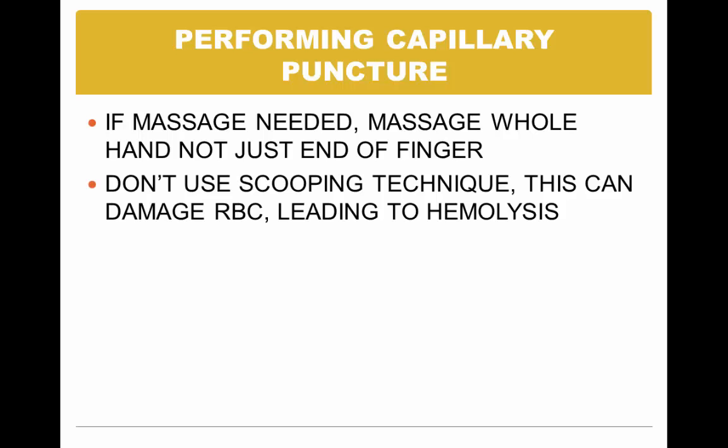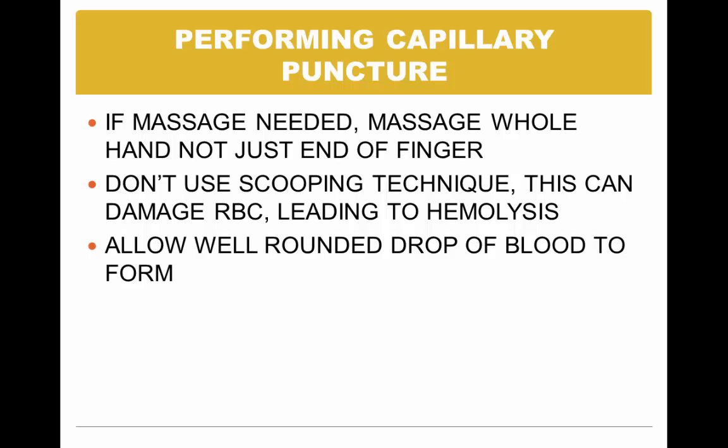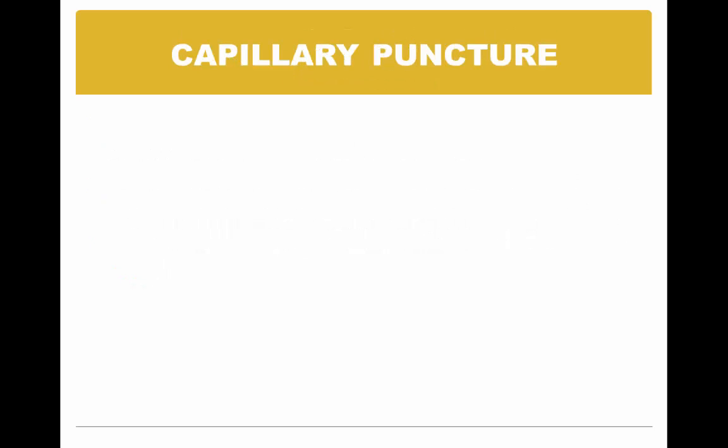If massage is needed, massage the whole hand, not just the end of the finger. Don't use a scooping technique. This can damage the red blood cells, leading to hemolysis. And make sure that you're allowing a well-rounded drop of blood to form. If the blood slows, you can re-wipe the puncture site. It will dislodge the platelet plug and allow blood to flow again.